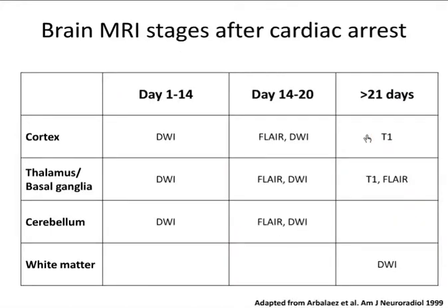So in the clinical setting, when we look at the different sequences that we use in MRI, what is the usefulness, especially with respect to time, of these different sequences and the location? We can break down the period after cardiac arrest into these epochs for imaging.